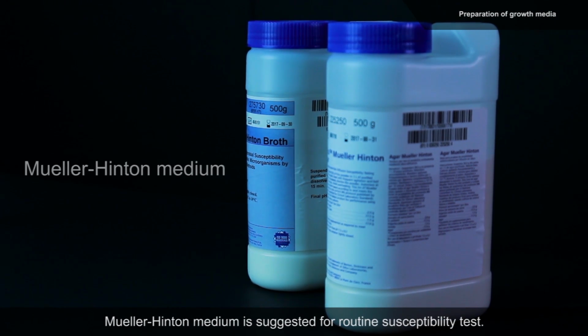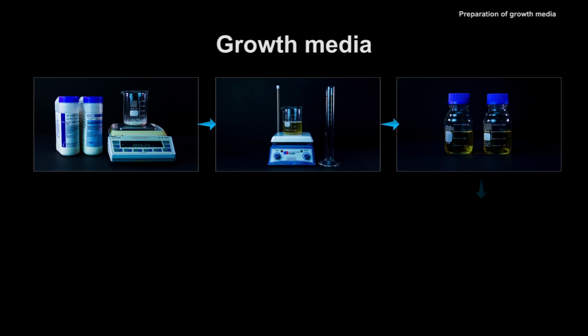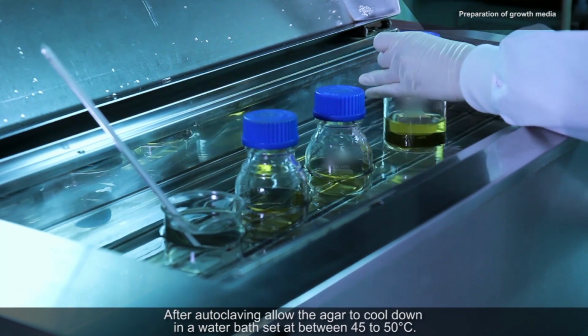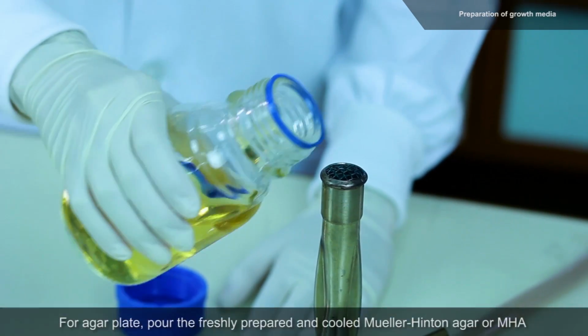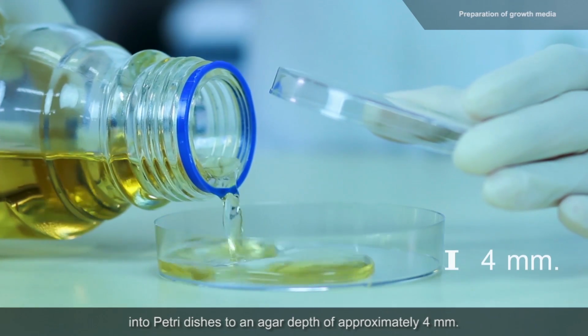Mueller-Hinton medium is suggested for routine susceptibility tests. Preparation of the agar should be done following the manufacturer's recommendation. After autoclaving, allow the agar to cool down in a water bath set at between 45 to 50 degrees Celsius. For agar plates, pour the freshly prepared and cooled Mueller-Hinton agar, or MHA, into petri dishes to an agar depth of approximately 4 millimeters.